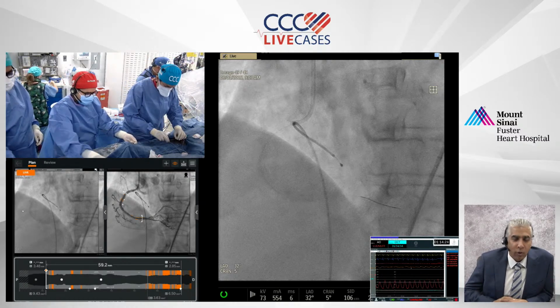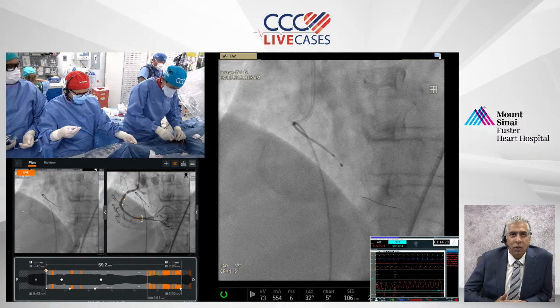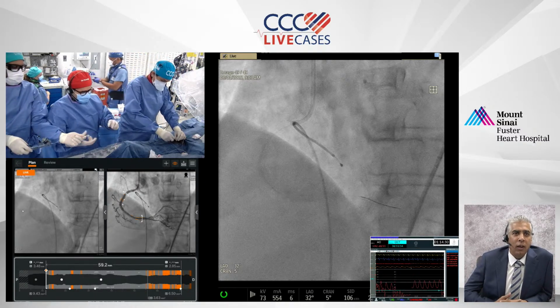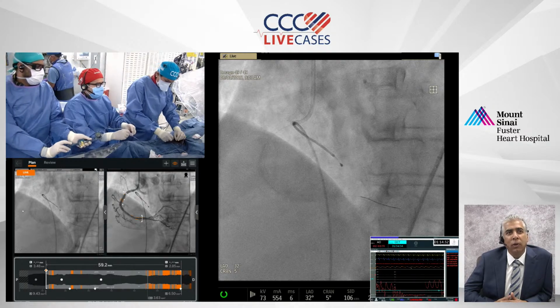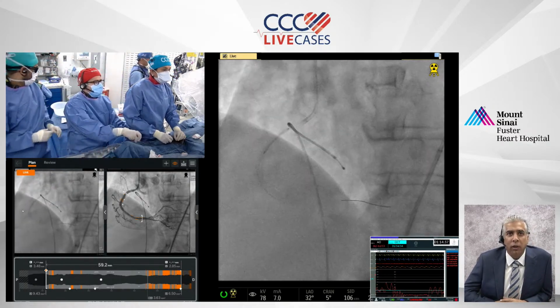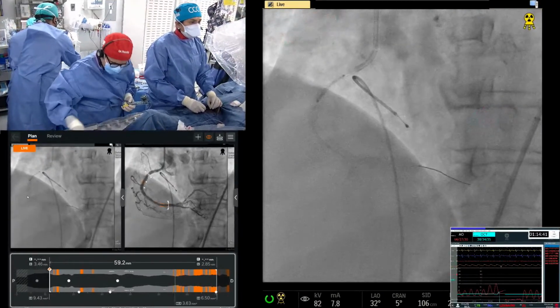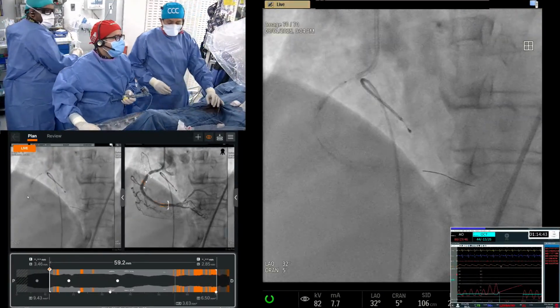Maybe I have one question, Dr. Kinney. Would you do this level of OCT in an RCA that was not as large as this one, or would you just modify your injection settings? You do have to modify, so that is why I think the RCA setting is less, and many times, remember, you don't need to use the assist, you can do it with your hand.